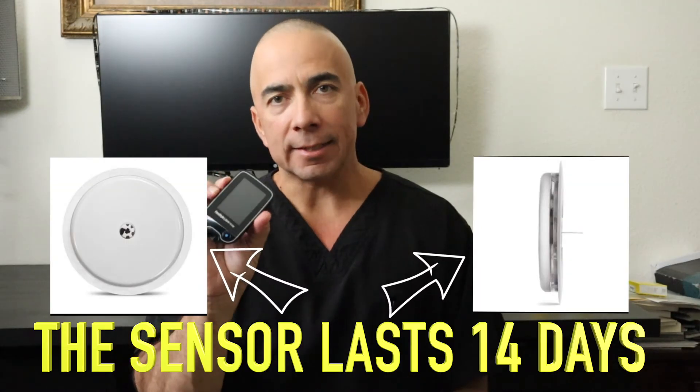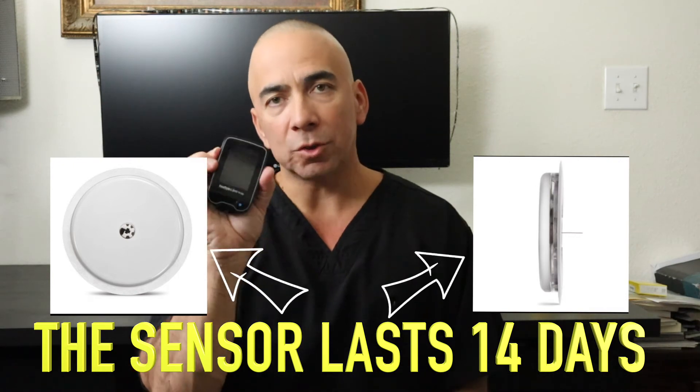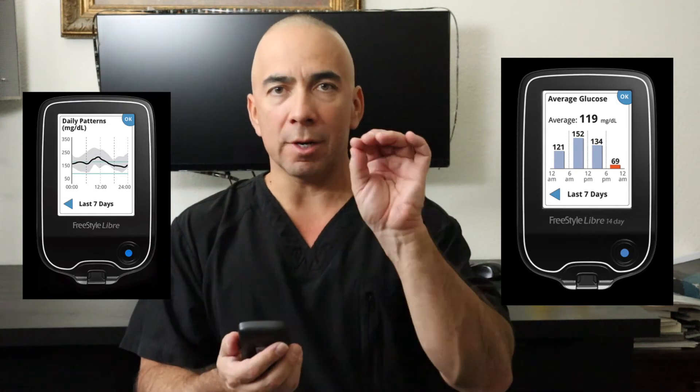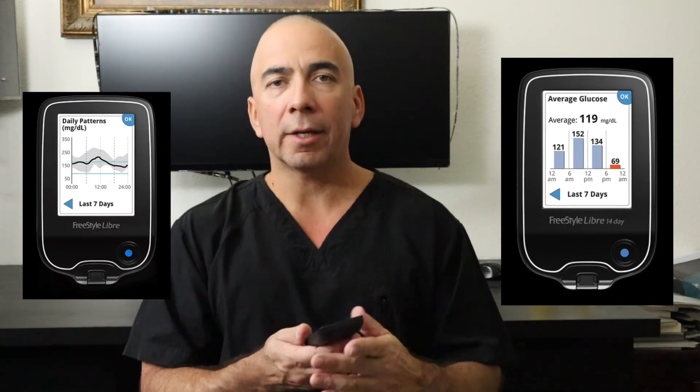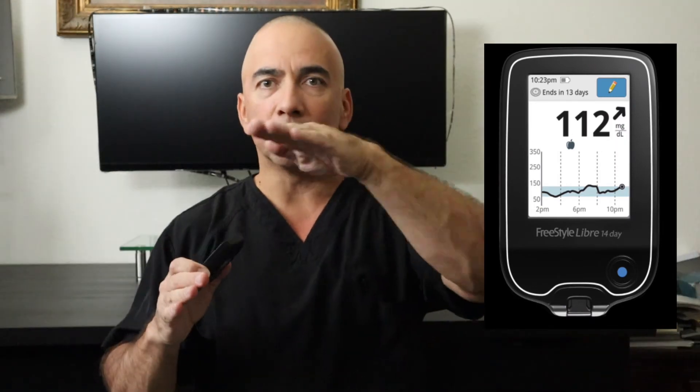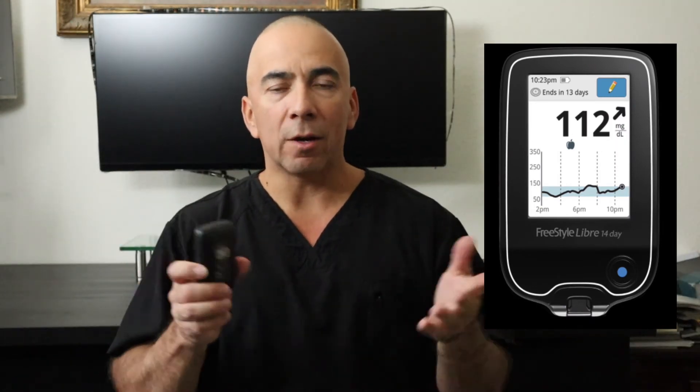These sensors last 14 days. It gives you an average and you can see trends — it gives you a little wave. When you scan, it gives you your number. You can go back and look at your history, and it provides a graph to show what your blood sugars have been doing for the past 24 hours.